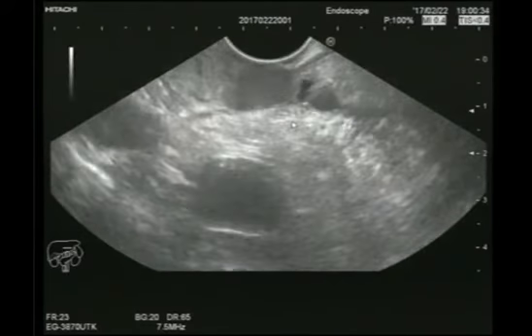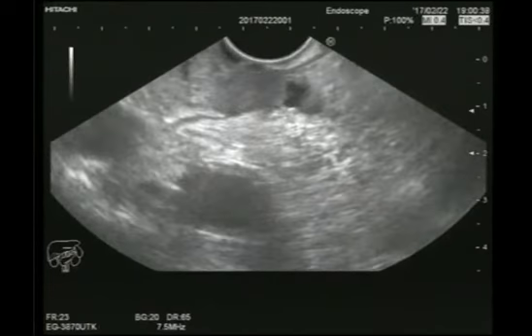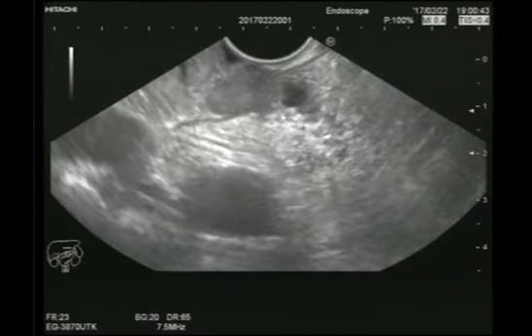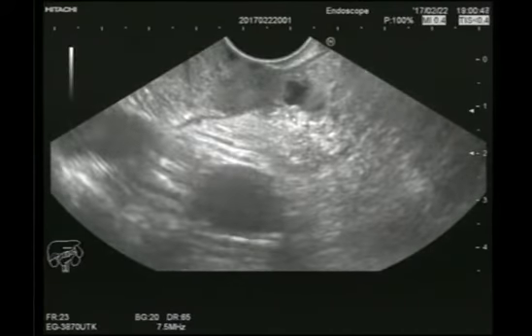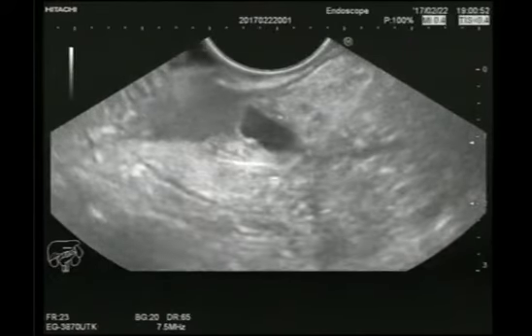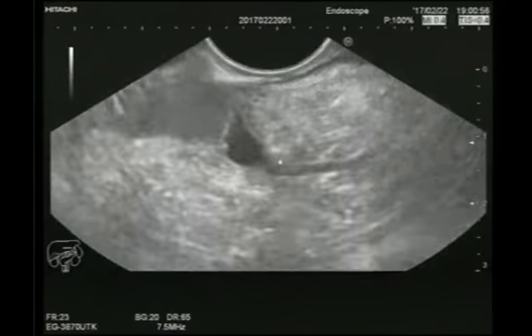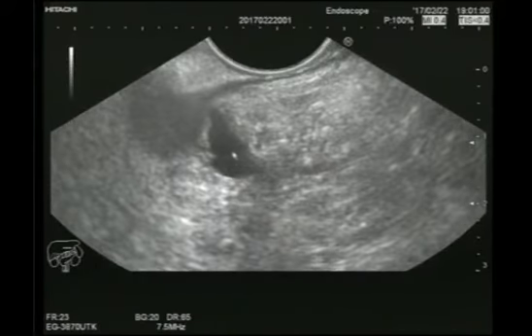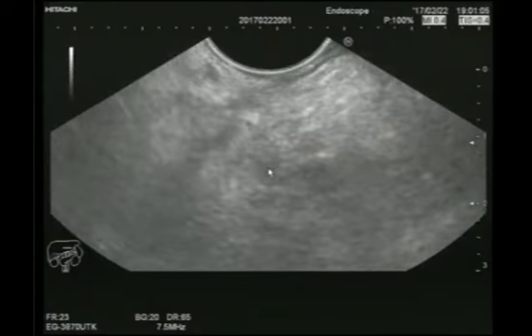You will stage the tumor and you will make a decision about the management strategy, and you cannot get this view with any other cross-sectional imaging. For papillary examination, the most competitive technique is EUS examination. We are going further back. You see the pancreatic duct invaded by the tumor and the stent. So this is a stage 3 papillary ampullary carcinoma or a villous adenoma.